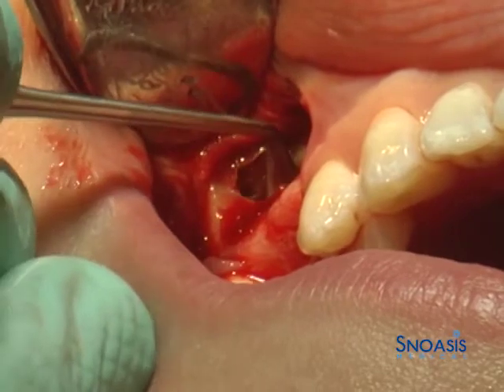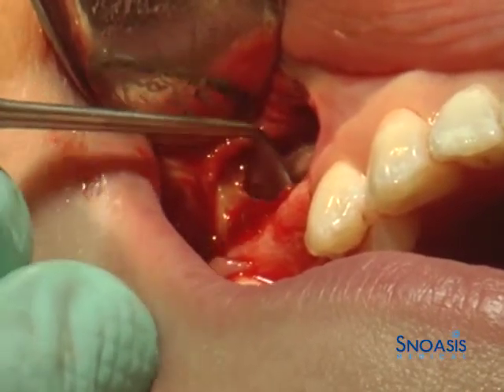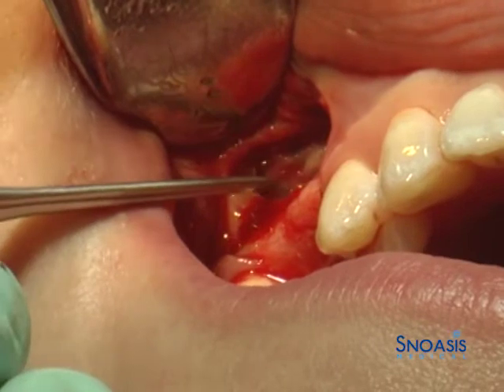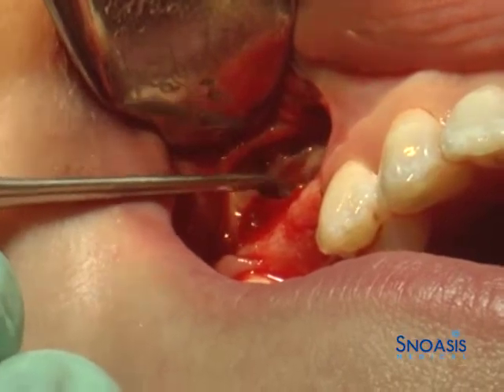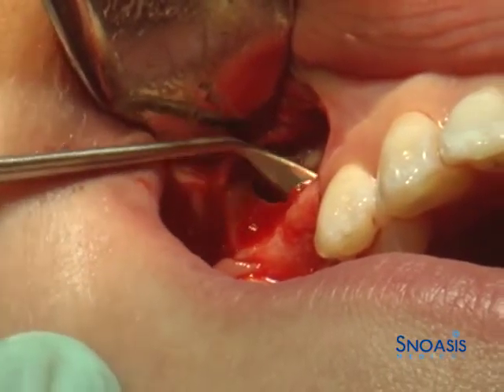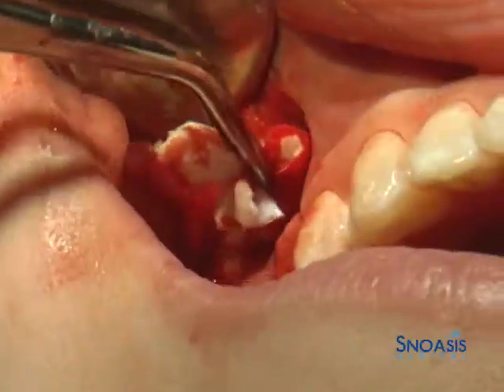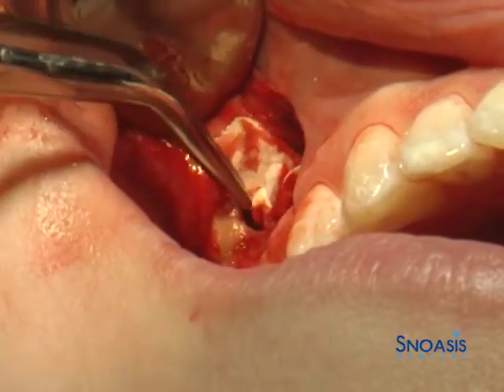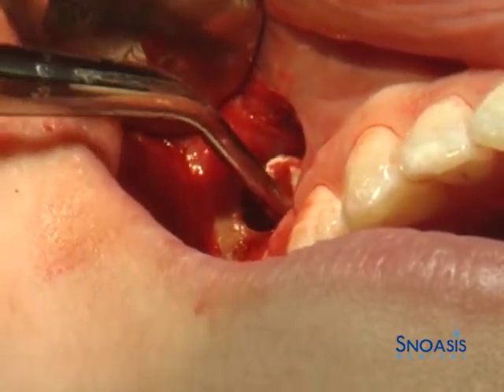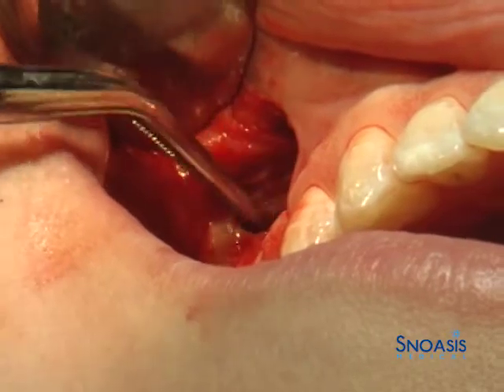Due to the simultaneous drilling of an osteotomy for implant placement and the desire to protect the Schneiderian membrane from the implant drills, a collagen tape material is placed into the sinus cavity prior to drilling of the implant osteotomy.